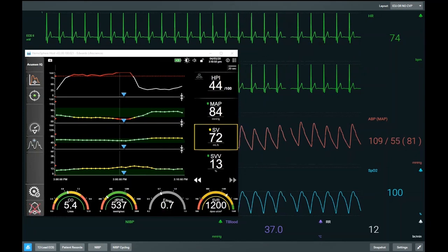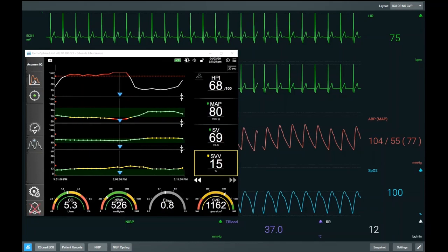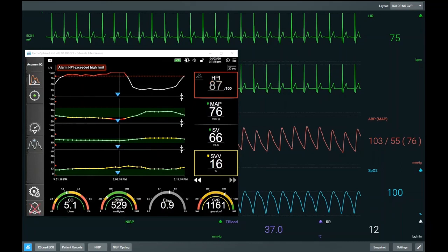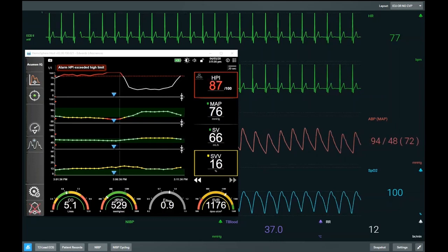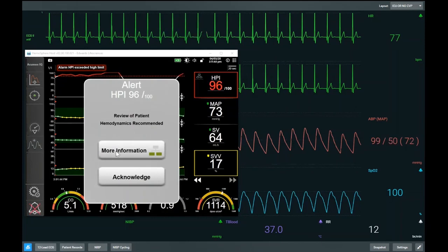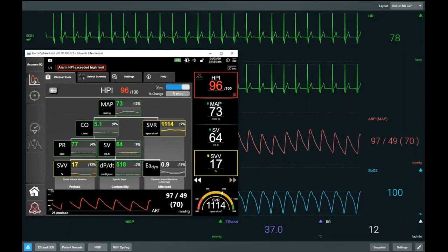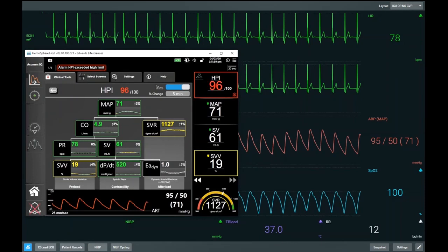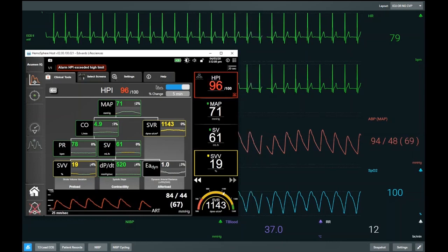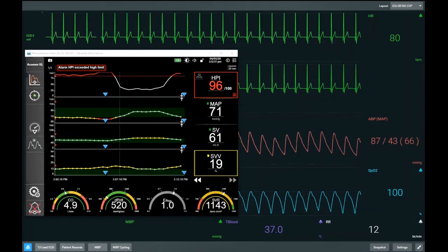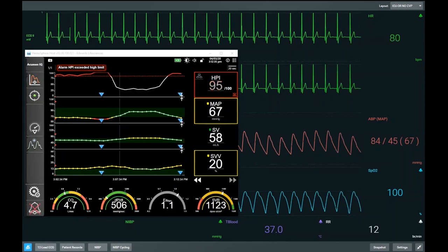Our HPI is now increasing again. The difference between our delta HPI and our delta MAP needs to be emphasized — the relative changes in HPI are much more substantial than the changes we see in MAP, which is still within a normal clinical range. Our HPI is above the threshold of 85 and will start to alarm. We know we are trending towards hypotension because HPI is raised. There is no significant change in cardiac output or stroke volume, but the patient is preload responsive — SVV is raised at 19 and our Eadyne is 1.0. So the three criteria for Eadyne to predict pressure responsiveness are now complete.